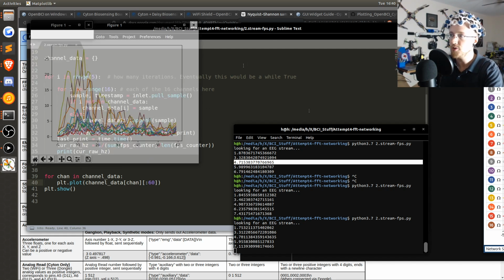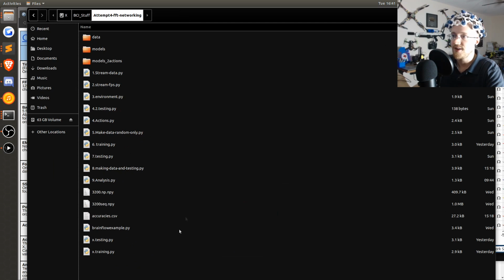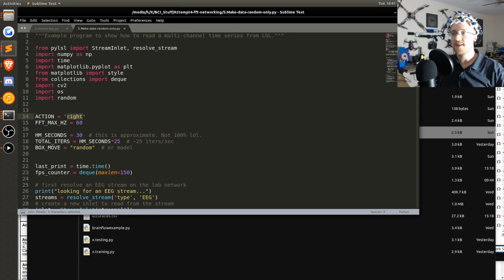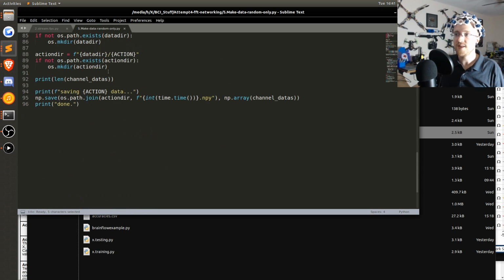and that will create what ends up actually being moved. So the first time I did it, it's basically just a bunch of code: stream, blah, blah, blah, environment. You already saw the environment, so I'm not really going to show that. This was the first time, because I didn't have a model to move something around. Basically, I say, hey, here's the action I'm going to think about, and then we actually run the environment. We run through that environment, and then we save that data to whatever that action is.